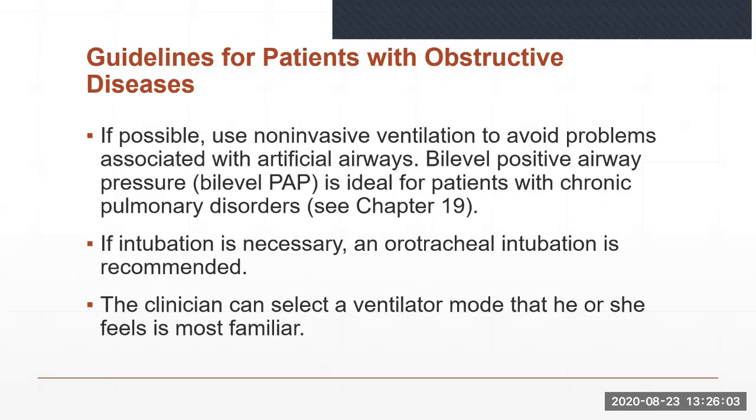PCCMV has a distinct advantage over PSV for this patient population because inspiration during PSV can be too long or too short depending on the patient's active breathing patterns. This can result in increased work of breathing and poor patient-ventilator synchrony. Auto-PEEP can be a lethal complication. Current ventilators that allow an adjustable expiratory flow cycle may allow for the use of PSV in your obstructive pulmonary disease patients.